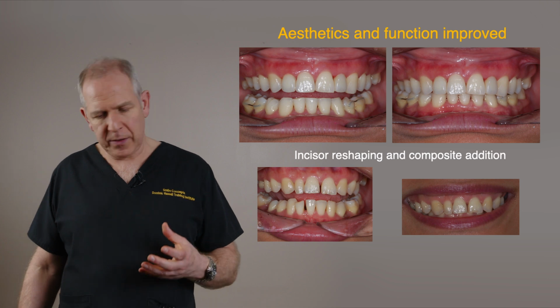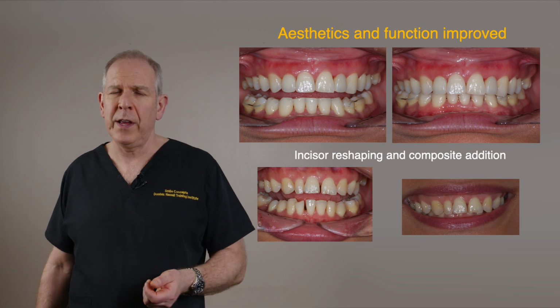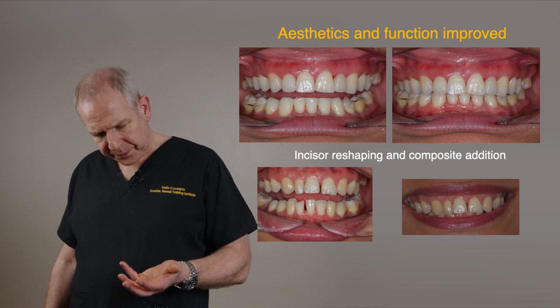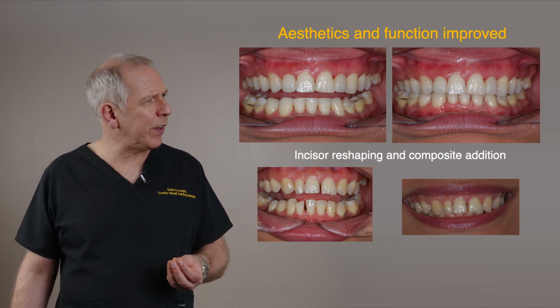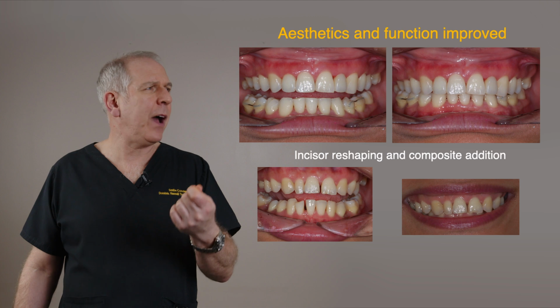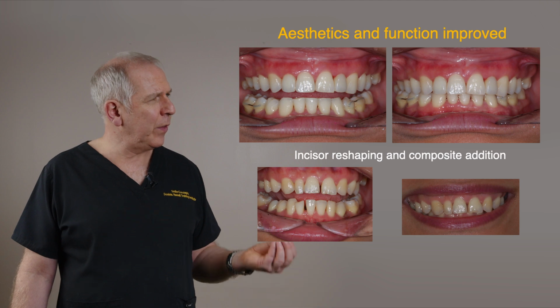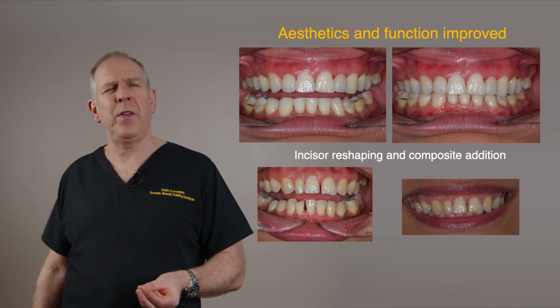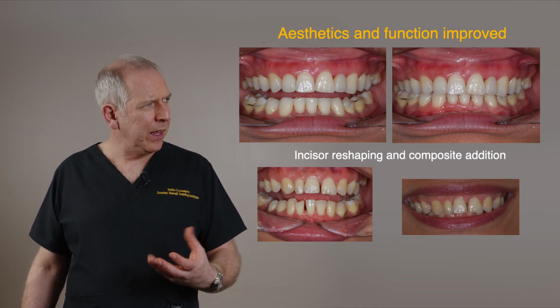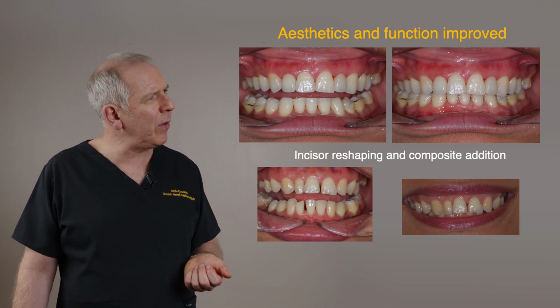And don't forget, the few studies we've got on zirconia adhesive bridges show very, very good results in the incisor region. So we've got our zirconia adhesive bridge, which again gives us a lovely result, and again using an ovate pontic technique, scalloping out so we get that nice emergence up there. So we've got an Emax crown on the right, a zirconia adhesive bridge on the left, which gives us lovely aesthetics. The patient's whitening went very well, so that gives us the opportunity to lighten everything up for her to give her a nice brighter smile.